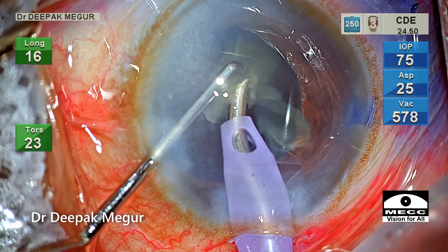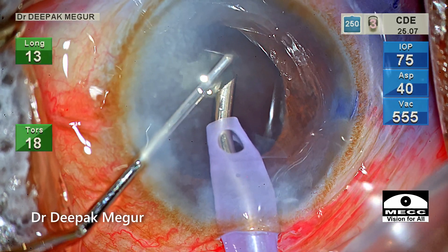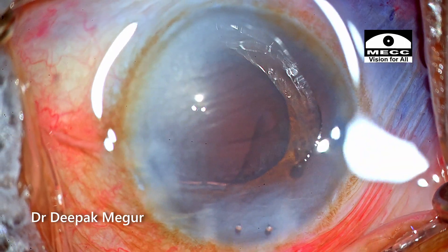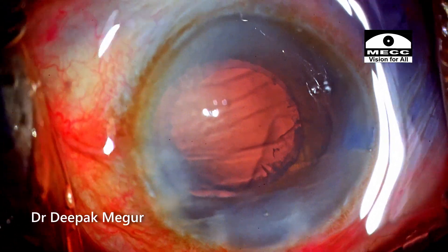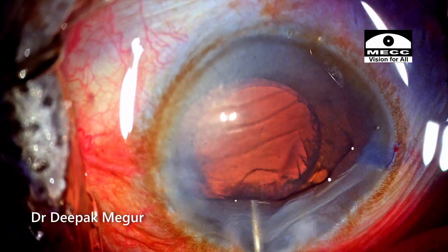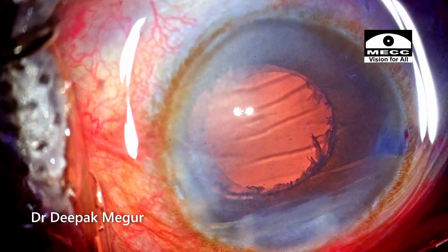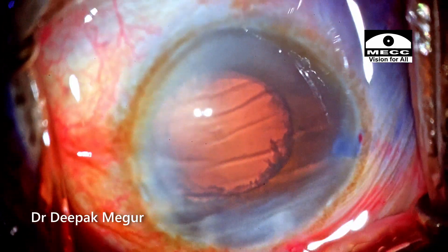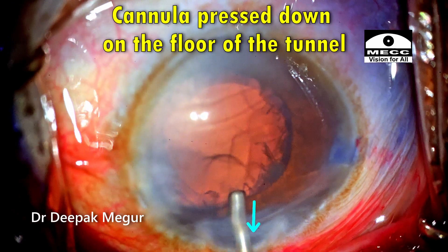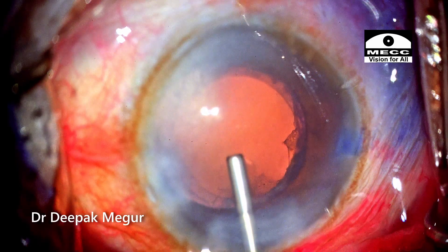I was quite anxious until the last piece was emulsified, with one eye always fixated on the Descemet's flap. I was extremely relieved when the last piece was emulsified and I carefully came out. I can see the tongue-shaped Descemet's membrane detachment has fallen back. Introducing a cannula through the main incision to flush the posterior capsule, I am careful that the cannula is directed more posteriorly so it doesn't get entangled in the torn Descemet's membrane. I'm introducing OVD again — the cannula is pressed down on the floor of the tunnel as it goes inside to avoid entanglement.